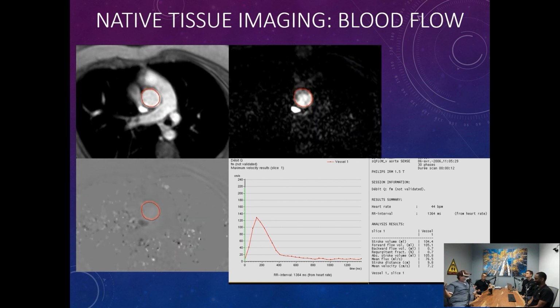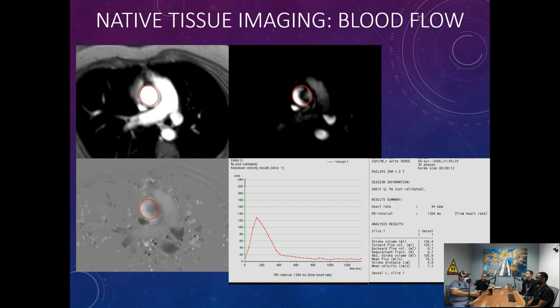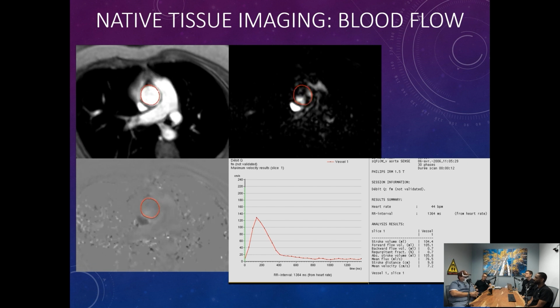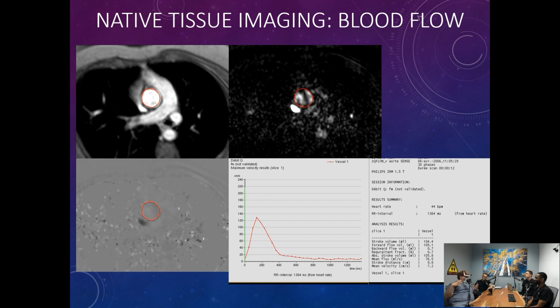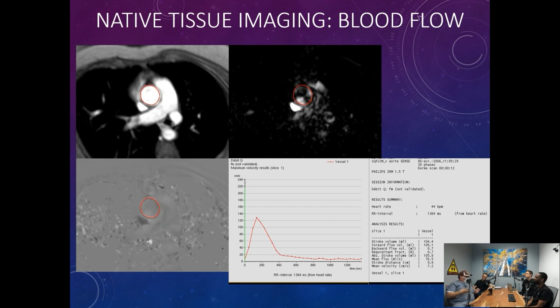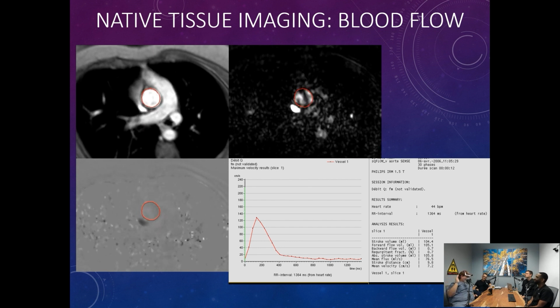And then the patient takes a different size breath and now you're too high or something, you know? One of the advantages of the ability to look in all three directions is that we have this volume of 4D data. The fourth dimension is time. We can load that into a post-processing program and retrospectively change our imaging planes to wherever we want.